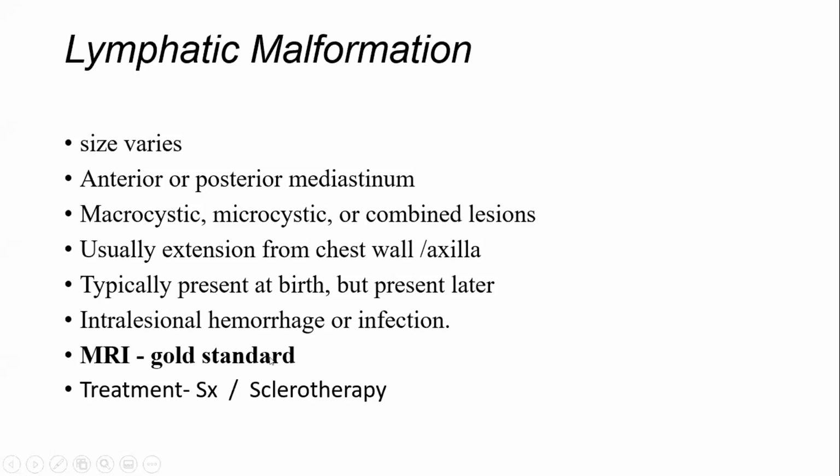Ideally, the soft tissue lesions are better characterized with MRI if you can get MRI. Treatment is surgery and sclerotherapy. Most of the time, sclerotherapy is good enough. Thank you very much.